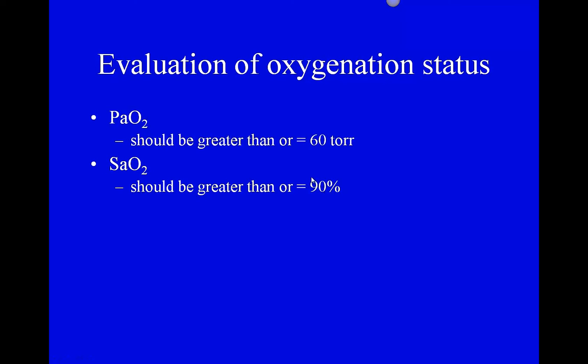When we take a blood gas sample and we look at the amount of oxygen, the pressure that's generated by that oxygen, we get a label that's in millimeters of mercury. So these are two different ways to look at oxygenation in the blood, and there is a pattern that they kind of follow, but it's important to recognize that one has a label that is percentage. That's your saturation of hemoglobin with oxygen. And this one is going to be a pressure measurement, and that's what that P means too. Pressure of oxygen in the artery. What do you think it would be if I had PVO2?